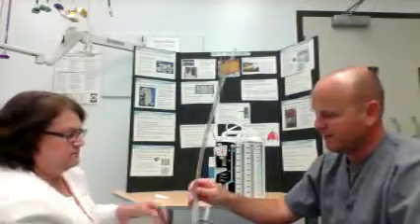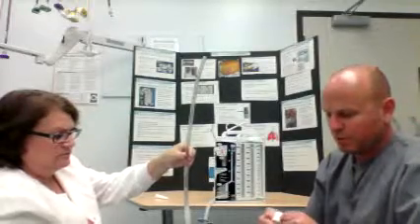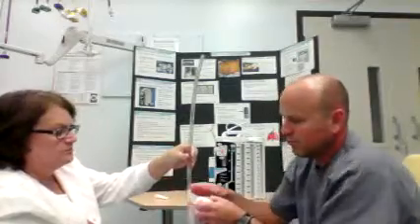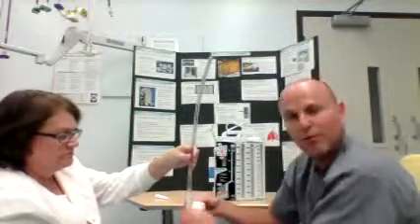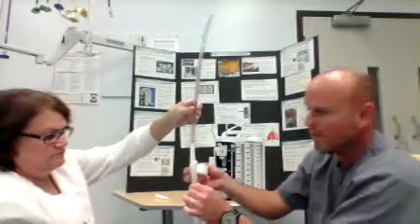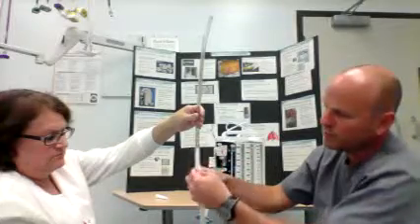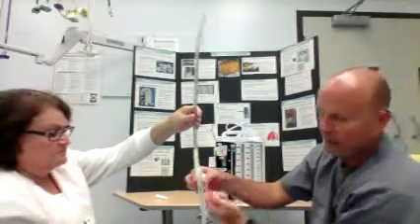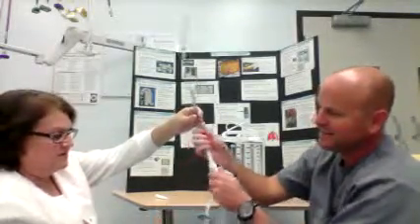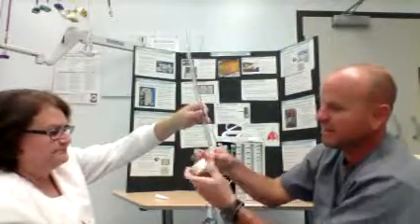Okay, if you could hold that for me. Silk tape works great, and what you'll see a lot of people do is they'll just do the old wrap around, wrap around, wrap around. This is not the preferred method, because if you have a lot of drainage and there's a small leak here, when this tubing gets wet, this round and round type taping makes it easy to slide it out. So you slid it out.